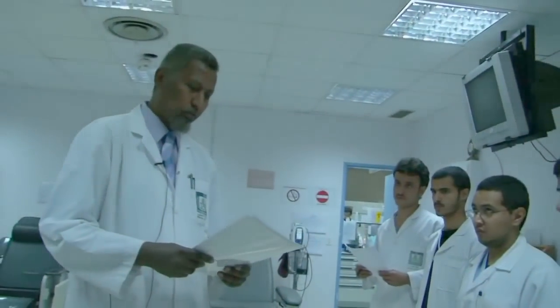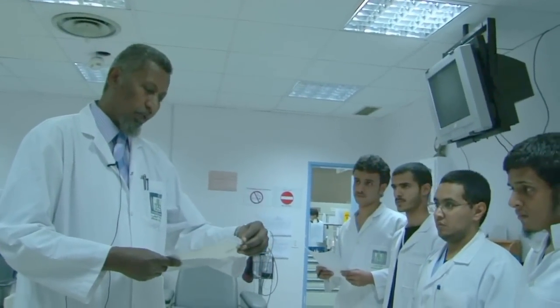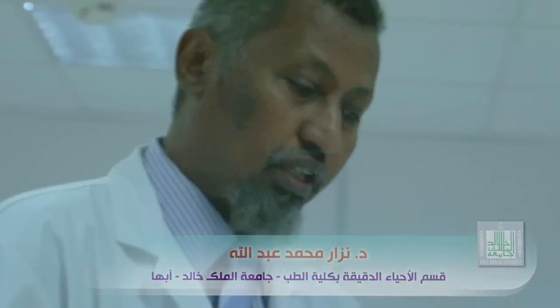This morning we are going to talk about this practical session in the laboratory of Asir Central Hospital. Here we are in the blood bank section, and we have our student from level 8 laboratory science student. This course is actually for quality control and laboratory management. And this laboratory management, we are going to take it as a first part, and then we'll talk about the quality control in this section.